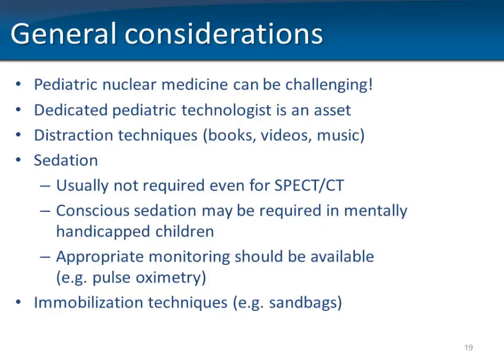So, having said that, pediatric nuclear medicine can be challenging. It is useful if you have educated pediatric technologists. However, in smaller departments, that is not always feasible. We all know the bag of tricks that we need to distract youngsters. Books, videos, music can all help. Luckily, I can say that sedation usually is not required for the studies we do, often in contrast to MRI. Even for SPECT-CT, we don't routinely use sedation. It is only used routinely for children who are mentally handicapped or otherwise unable to cooperate. If you do, of course, use sedation, then the appropriate monitoring should be available. And various immobilization techniques can be useful, for example, as other tools.